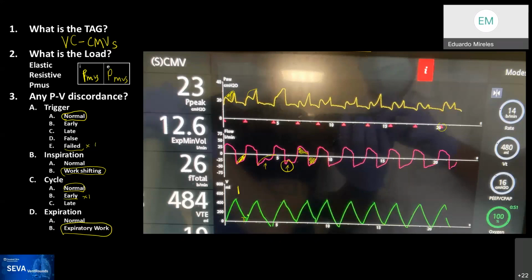The next breath gets triggered. The patient gets exactly the same amount of tidal volume because it's volume control, right? Now the patient exhales. What exhales? More, right? Because remember that it resets the volume measurement to 0 whenever you start a breath. So if the patient had more air inside, then it will be able to exhale. Or if the patient coughs, you still can cough more from the residual volume, right? The next one, the patient takes a breath in, there's a little bit of air that gets trapped, and then the patient exhales the rest of it. There you go.